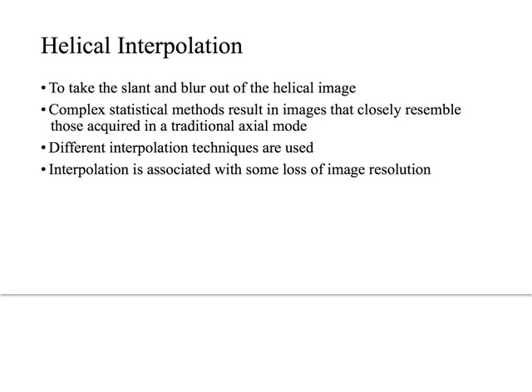So we are rotating the scanner around and around as we're moving the table through, right? So we've got two different kinds of interpolation that we can do. We've got 180 degree, and I think I've alluded to this in the past, and then we've got 360, right? The way that the 180 degree works is it's going to take 180 degrees of tube travel and interpolate that data back, right? It's going to back project that amount of data.